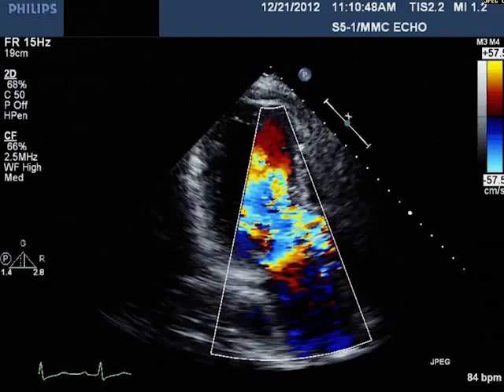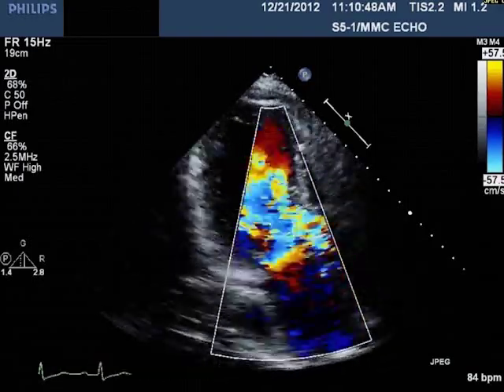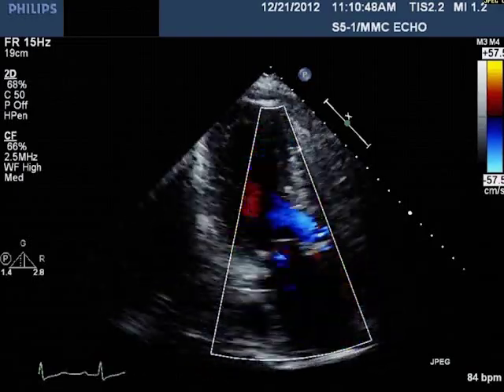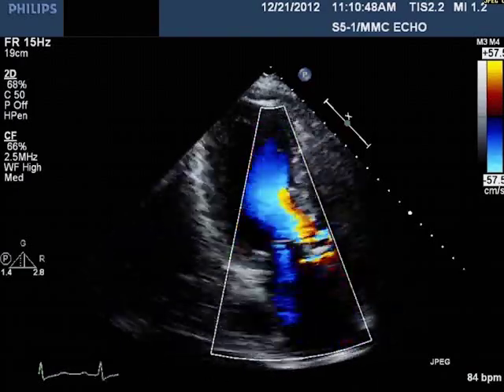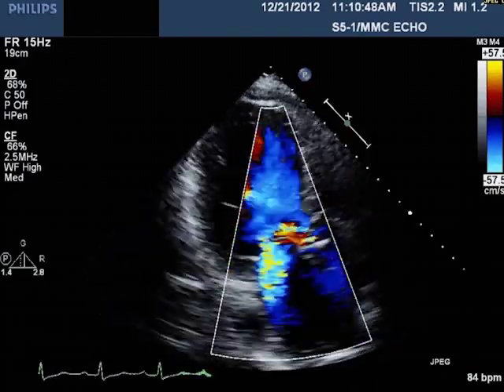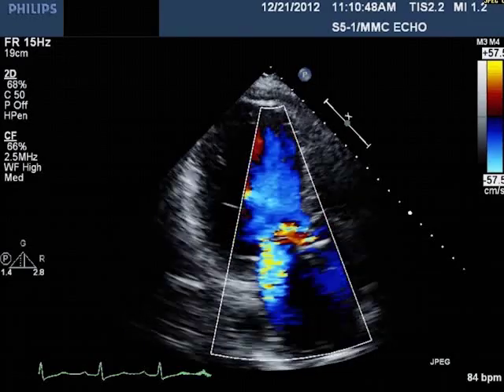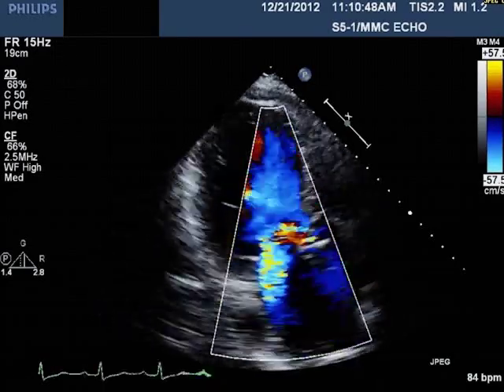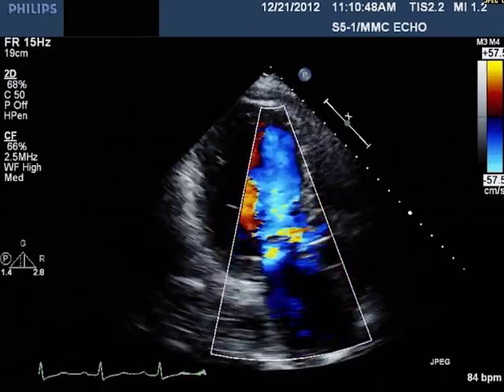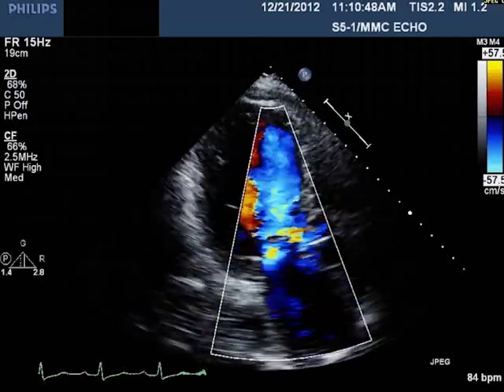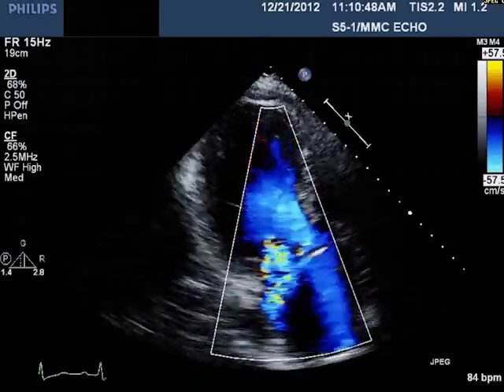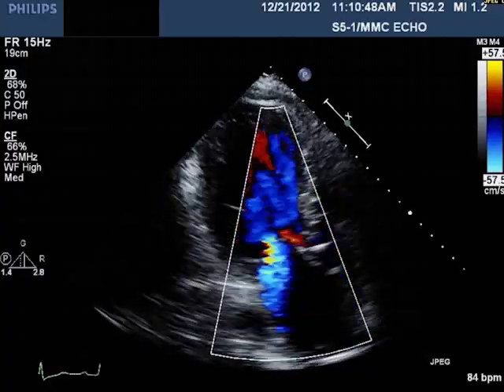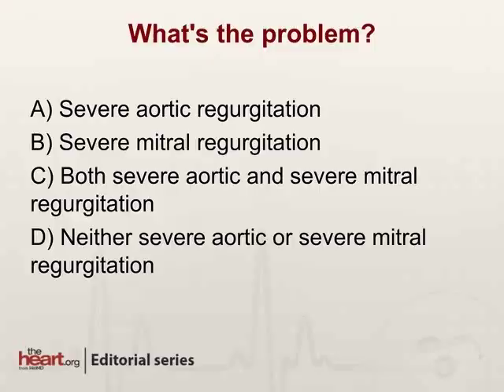Here is an image from a 60-year-old gentleman who was admitted because of severe congestive heart failure and shortness of breath. This is the apical three-chamber view — let's watch that play for a little bit. After you have a chance to look at the image, and again this is a three-chamber apical long axis view with color, what would you say the problem is?